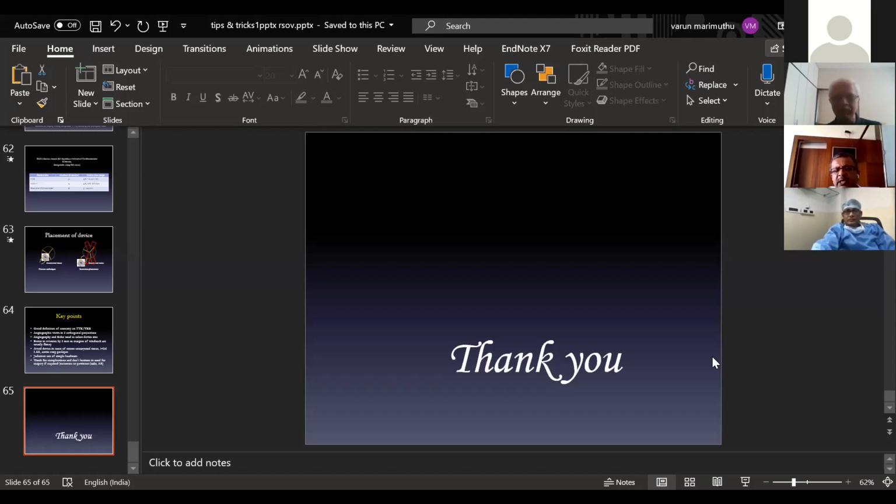Okay, I think balloon sizing is not required, and most of the groups don't do balloon sizing. Now, when you do sizing of ruptured sinus of Valsalva, where do you size it? At the aortic end or at the site of rupture? No, at the aortic end.